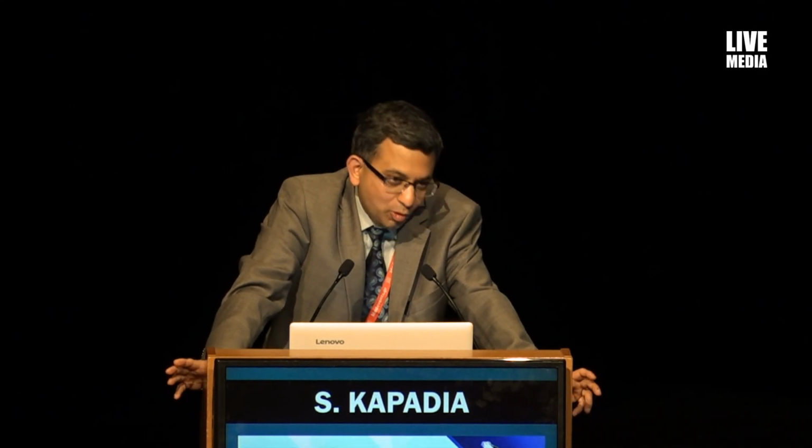The reason is very simple for me. The main limitation of the Edwards valve, as you know, is patient-prosthesis mismatch in people with a small annulus or valve-in-valve. If we have such a patient, then we use a Medtronic valve.